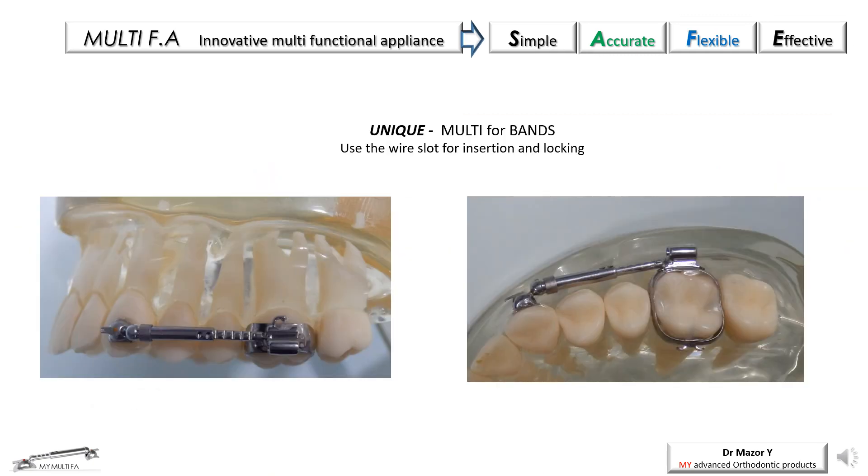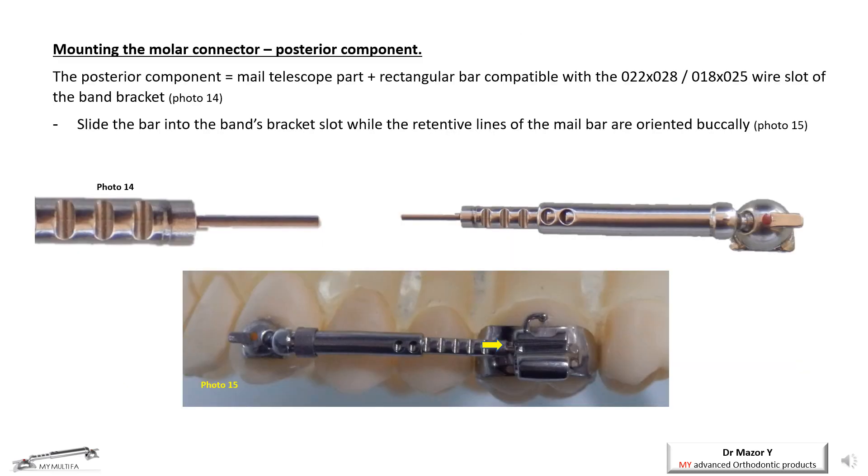A unique form of the Multi-Appliance is the Multi-Band. It was designed for cases that require the use of bands on molars as a primary step, or for clinicians who prefer bands on molars instead of tubes. The mounting of the Multi-Band is simple. The male connector of the telescope presents a wire extension, which is inserted in the band wire slot and can be used for both 018 or 022 slots. The posterior component of the telescope (photo 14) is inserted in the wire slot of the band. Make sure the telescope retention lines are faced buccally (photo 15).